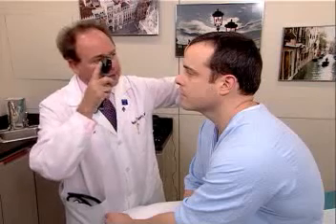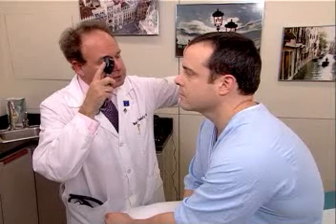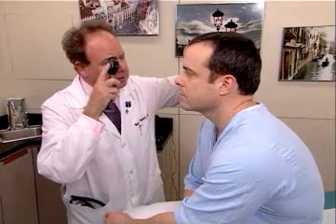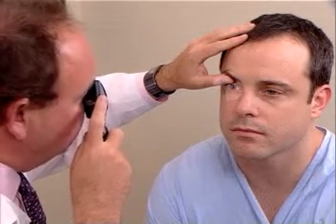You should stand approximately 15 to 20 degrees off midline and elevate the patient's upper lid as the ophthalmoscope is placed against your right eye to examine the patient's right eye. The first thing that you'll notice is the red reflex. If a red reflex is not seen, one has to be concerned that there may be some opacity, such as a cataract, in the lens.